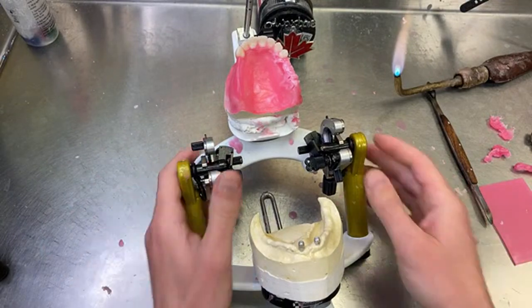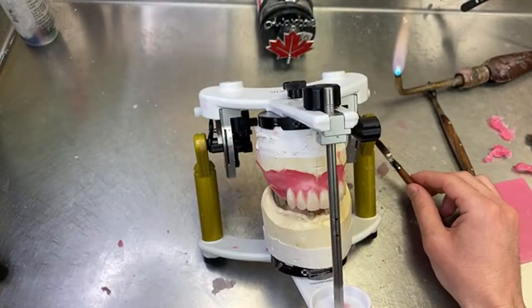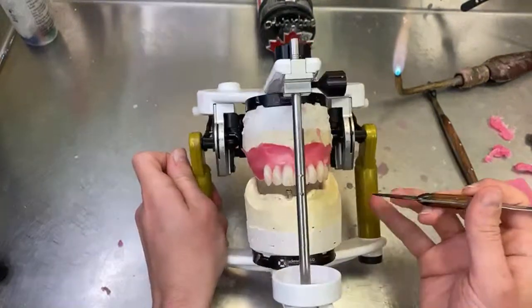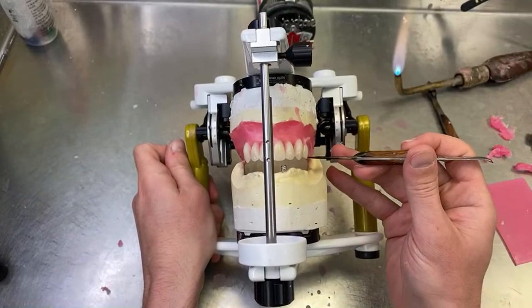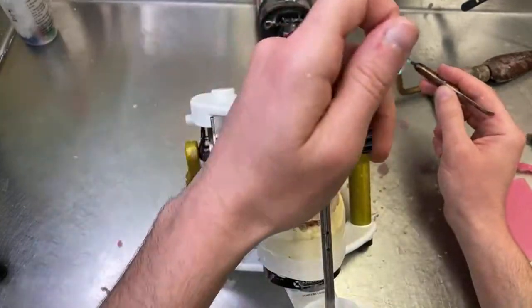No table for your orientation. No, you have your eyes. That's your best table, because I can look straight from where I'm sitting right now. Probably you can't yet. I'm seeing where the retromolar pad is going to be and where I want my plane of occlusion to be.